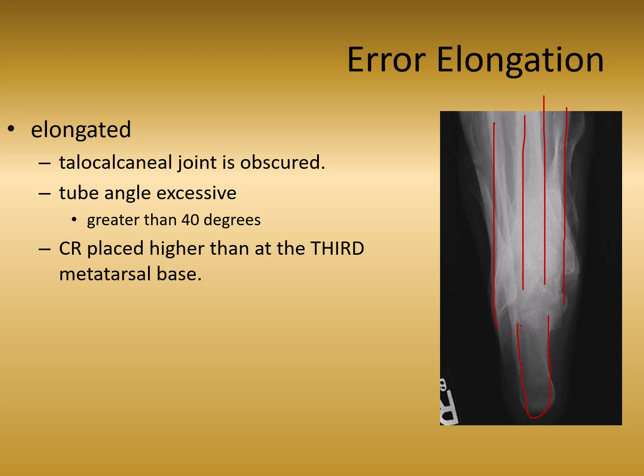So the central ray was placed too high, projecting those metatarsals down over the area of interest, which is the talocalcaneal joint. So this one definitely would be a repeat. It is definitely not diagnostic at all. The talocalcaneal joint is not clearly demonstrated in this position.